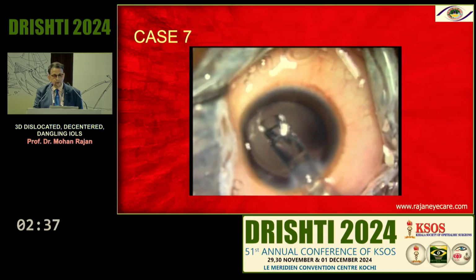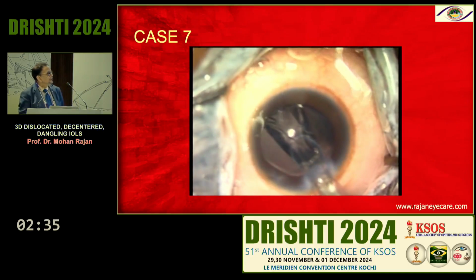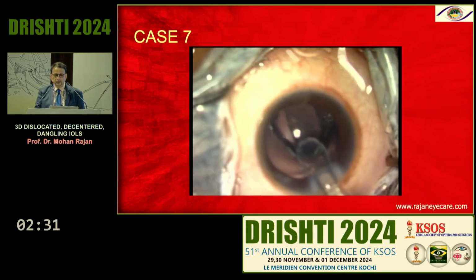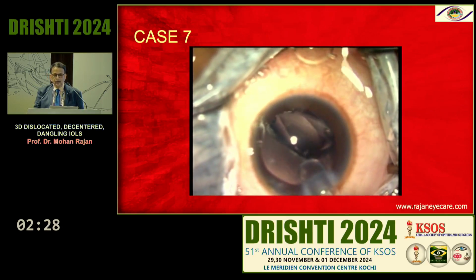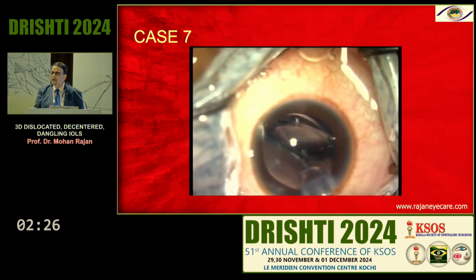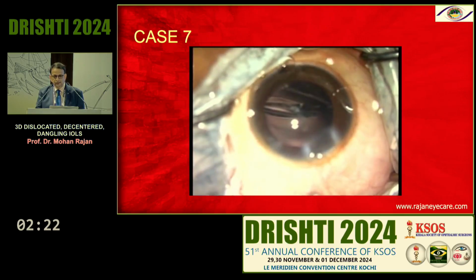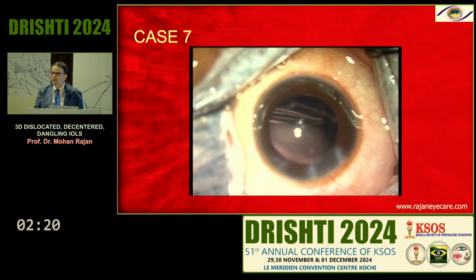So quickly I will go through, because this is another patient. You can see here, this is a Supraphob lens. When the Supraphob lens came into the market, they didn't have an injector. So I used the Alcon injector. The message is, don't use one company's injector for another company's lens. Suddenly it came with a jerk and produced a PCR.